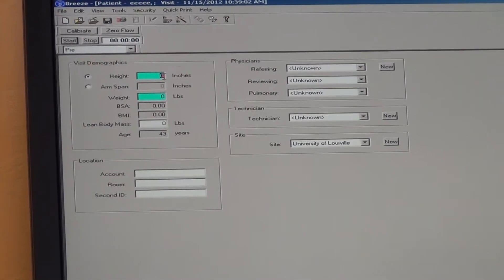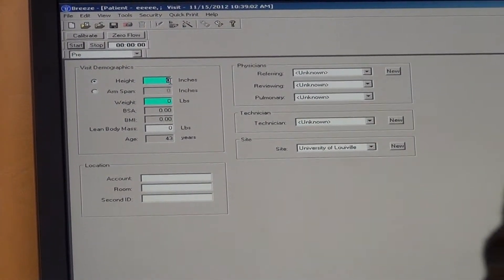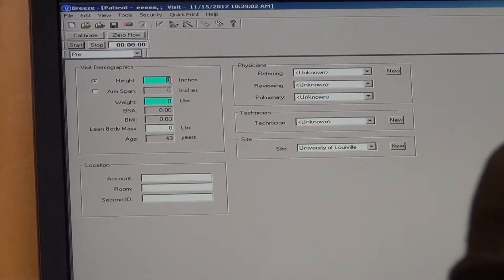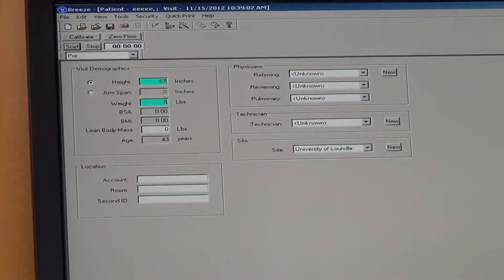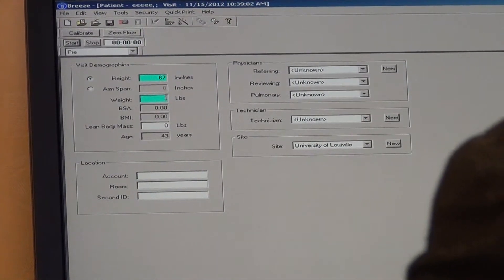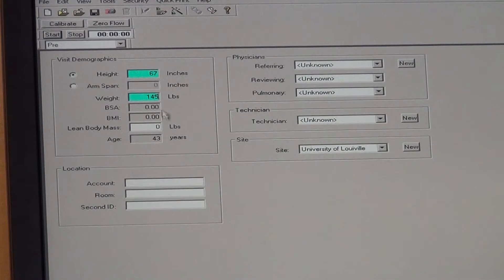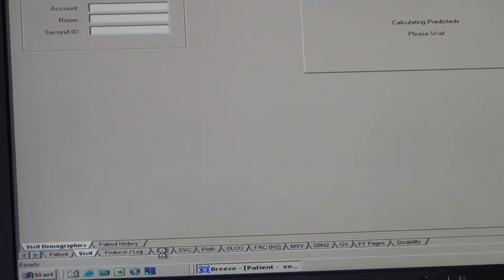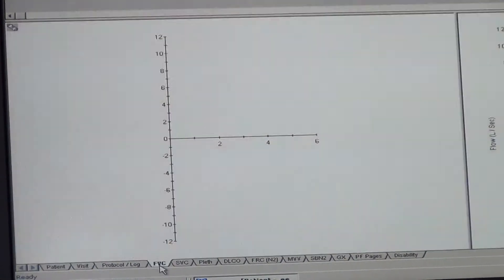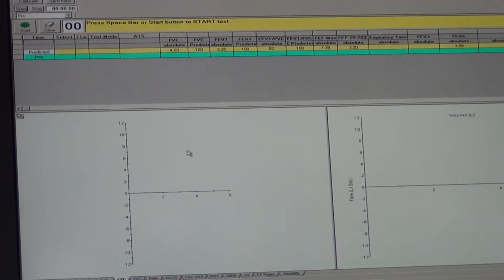This takes you to a screen where you have to answer some more questions. You have to enter the height and weight of the person being tested — 67 inches. The weight is in pounds. Then go down to the bottom and press the FVC tab. This will calculate predicted values for the test. The predicted values are shown at the top.